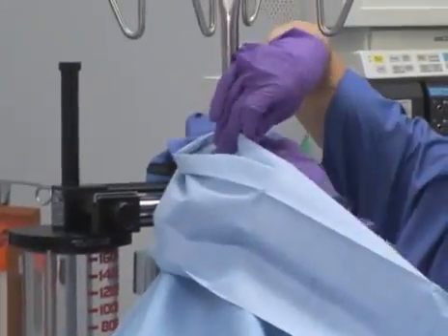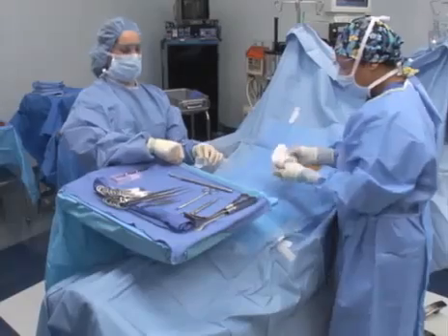keeping your hands on the sterile side of the drape or towel. Use only non-penetrating towel clamps for securing drapes. A hole in a drape allows a passageway for bacteria to contaminate the sterile field. When drapes are stapled to the patient's skin, the stapled area should be covered by an impervious plastic drape.